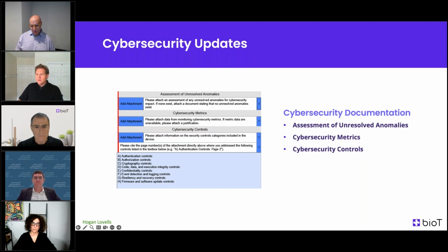One thing that we noticed starting in January 2023, right after the omnibus was signed, was the same 30 boilerplate deficiency questions. Almost every client was getting these across the board. And now if you don't provide those security questions, we're still seeing those boilerplate deficiencies. So make sure you've answered each one of these cybersecurity controls.